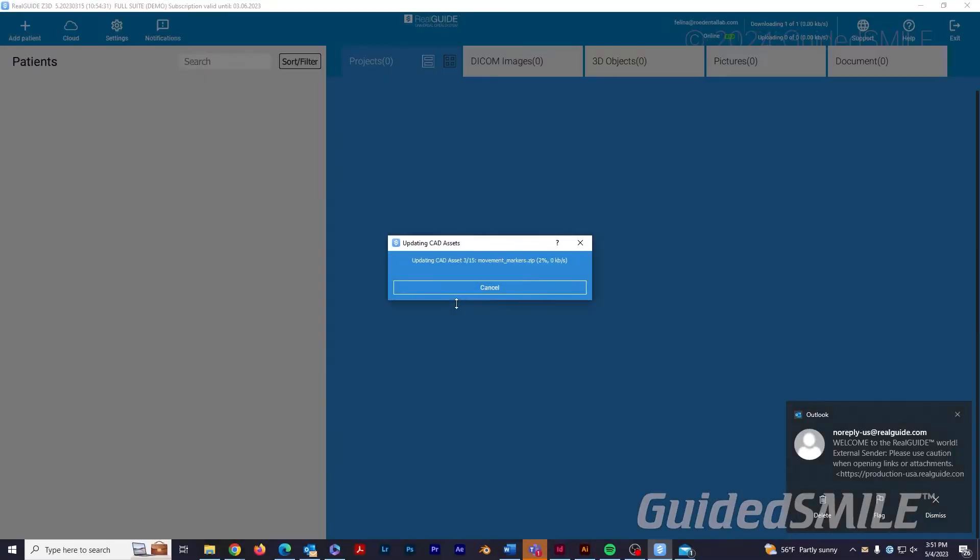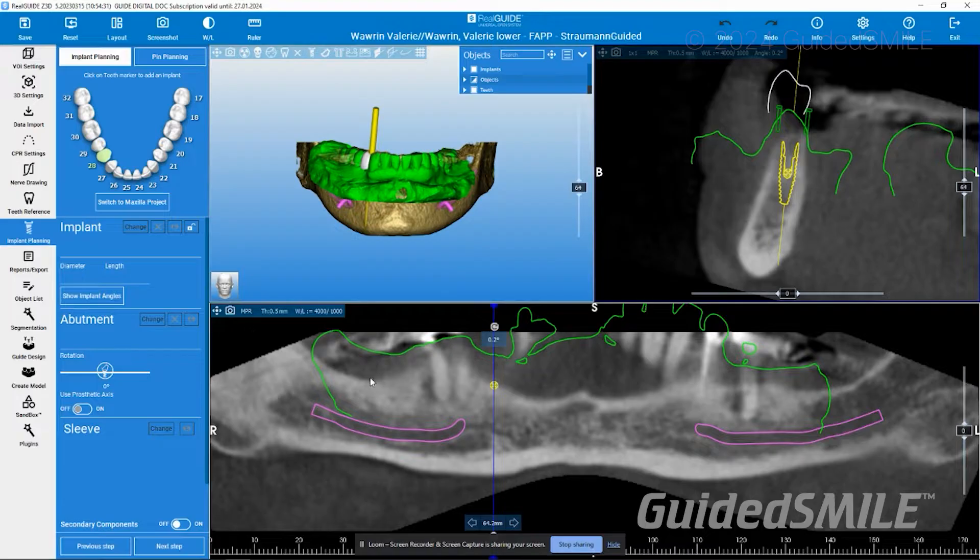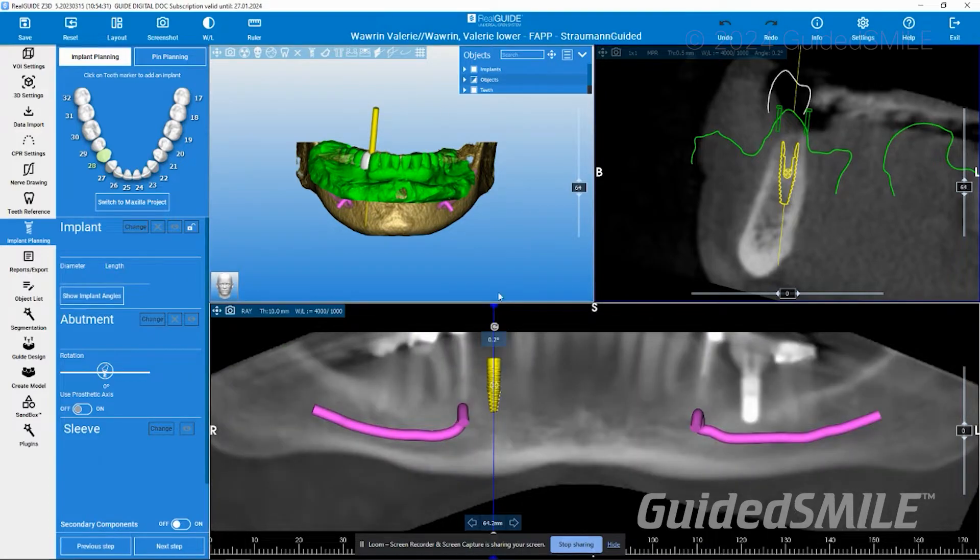One of the things I love about RealGuide is their tutorials and training. There are a couple different ways depending on what level you are — we always like to meet you where you are. If you're a beginner, you download the software, click the little button on the top right, and they have easy-to-follow tutorial videos.